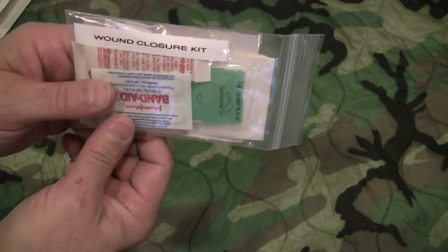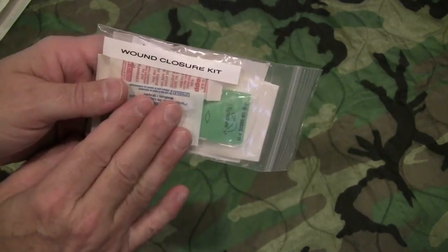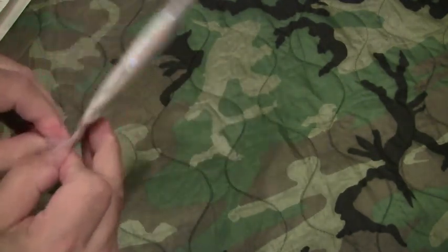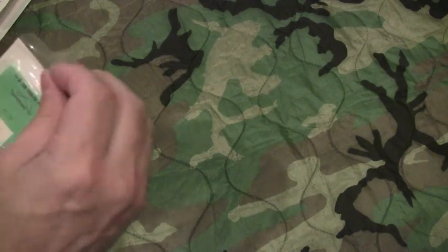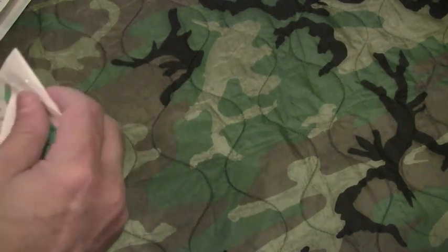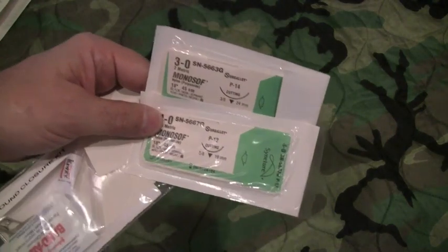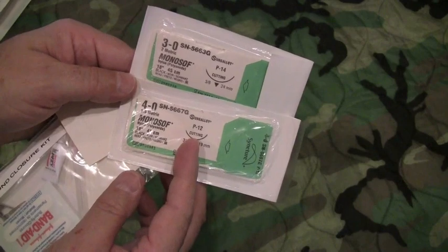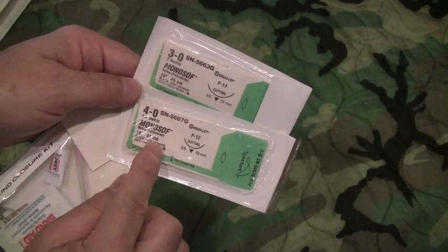This is the wound closure kit. So this is the stuff you're going to use when Band-Aids don't work. Let's go into this kit. So we've got 2 packs of suture material there, 4-0 and 3-0, with a large cutting needle and monofilament line.